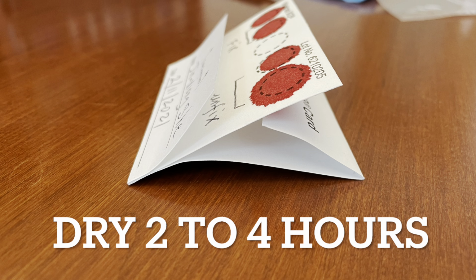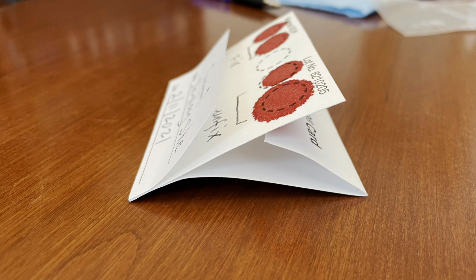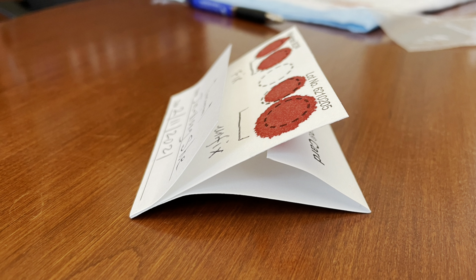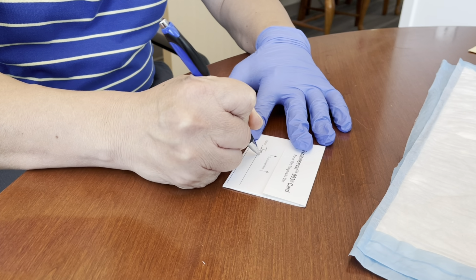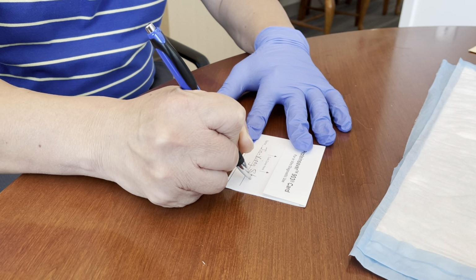Allow your filter paper card to air dry for 2 to 4 hours before you use the NAD fixing buffer. Fold the cover flap behind the blood spots like this to allow for air circulation. After your card has dried for 2 to 4 hours, be sure to write your name and the date of your collection on the bottom flap of your filter paper collection card.